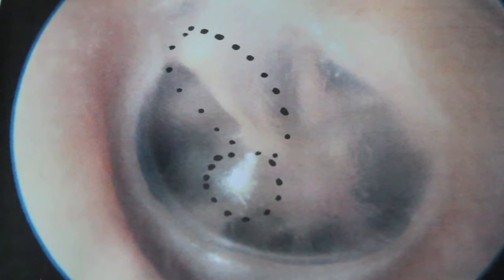So the first thing you should do is comment on any wax in the ear or any abnormalities you see, including an inflamed ear. Next, you should move the otoscope further into the ear until you can see the tympanic membrane and the landmarks. This is an example of a normal tympanic membrane.